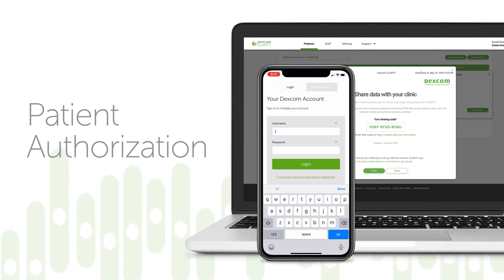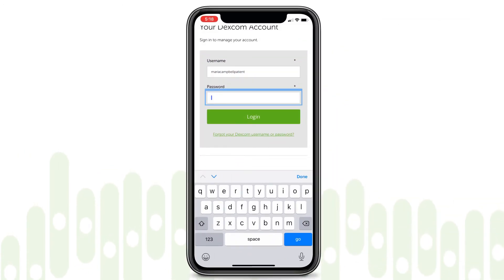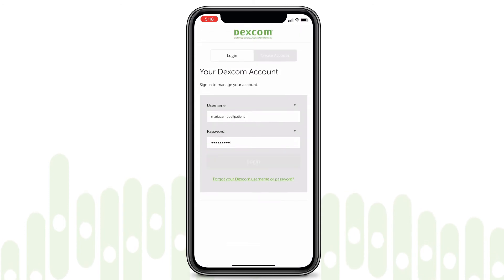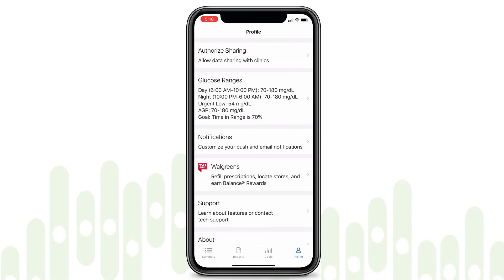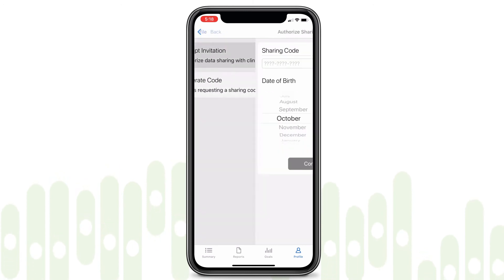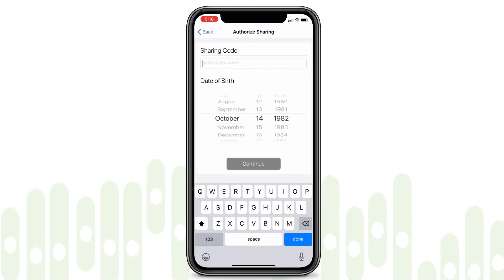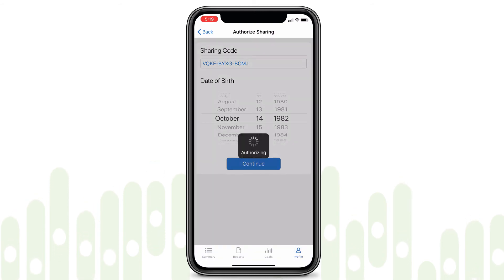After downloading the Clarity app, patients log into Clarity with their existing Dexcom CGM app account information. Patients tap Profile, then authorize sharing, then accept invitation and enter the sharing code provided on the invitation.